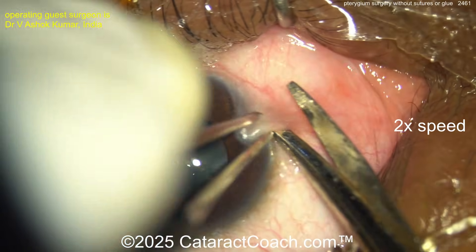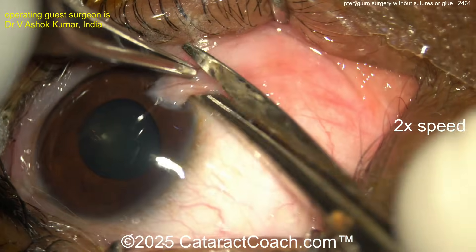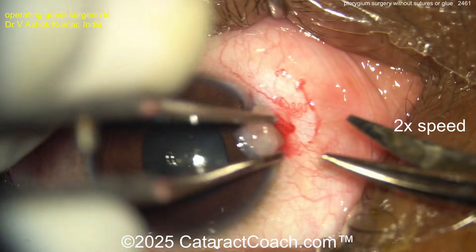Using the Westcott scissors, getting underneath the pterygium here. We'll probably cut it off, create that little stump, and that can be peeled off the cornea. There we go — cutting it off.